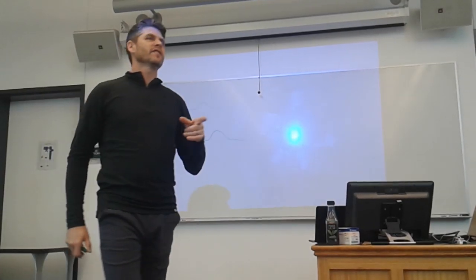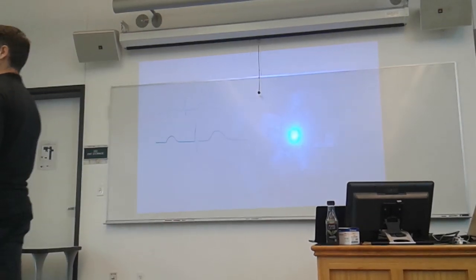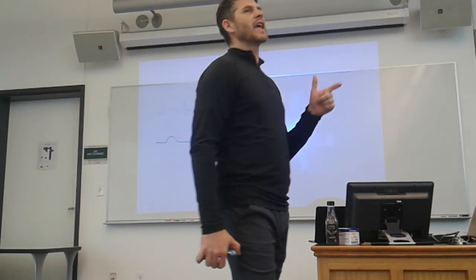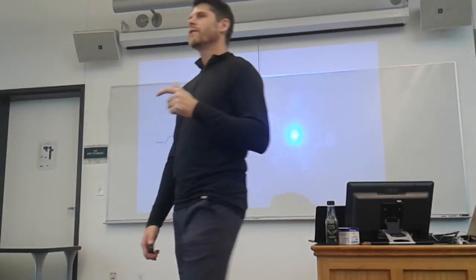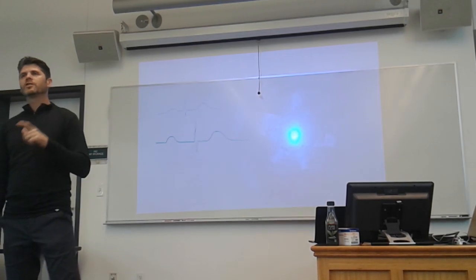Okay, so here's what you have now. You have a normal sinus rhythm. There is a problem in the AV node. That problem is not consistent. Or let me change that.